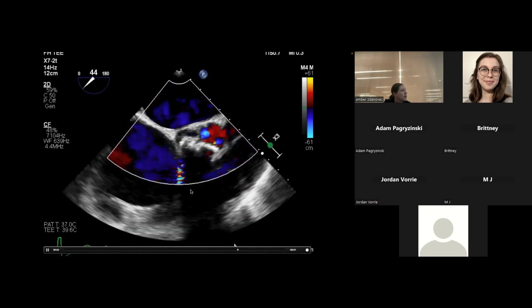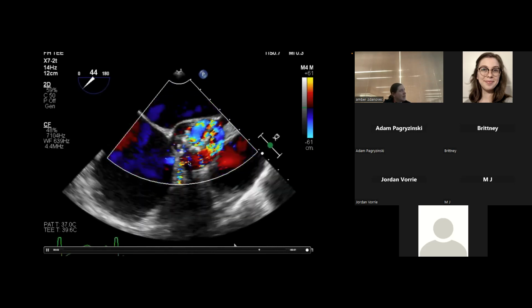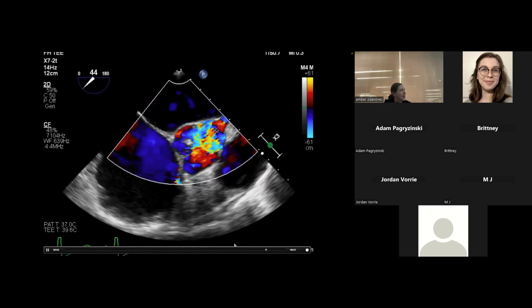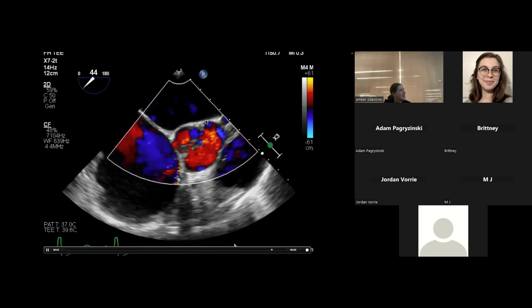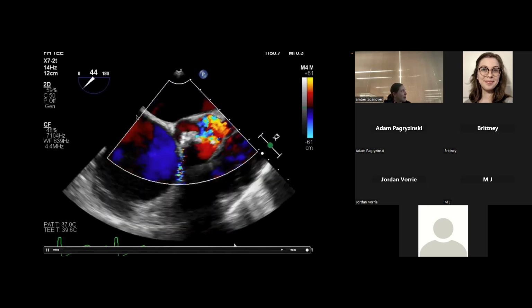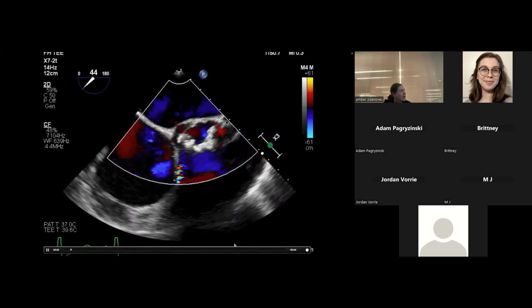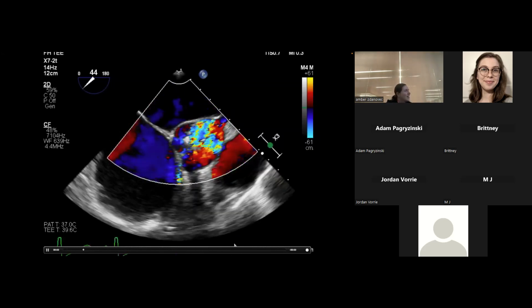So what part of the heart is this? What ventricle's down here? RV. So what cusp is this? The right coronary cusp. Yep, yep. And then I always think, what's up here? LA. Yep. So what cusp is this? So that's going to be your left coronary cusp. And then I always think this cusp is non-coronary because it's right by the septum. It has no loyalties. So this could be your left coronary here. But does that look like a normal left coronary? No. Looks big, right? Yeah, it's bigger than usual.